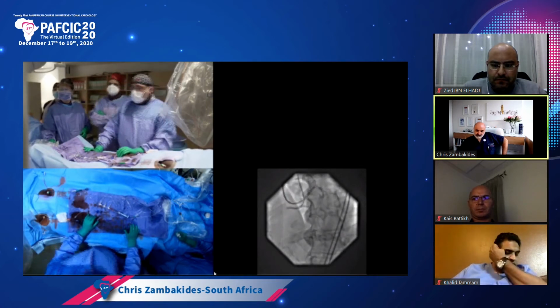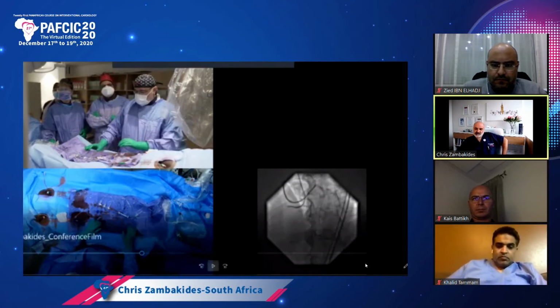Right. What I haven't shown is that this was such a diffusely diseased vessel that I tried to do a tip injection and you could hardly see anything. And that's why we're doing an injection in the LAD. So normally what you do is once you get it down, you've crossed, and you're in the small vessel, as we saw in one of the presentations, you remove your wire and you do a tip injection, and that will then show you exactly if there's a little microchannel, where the bifurcation is, etc.